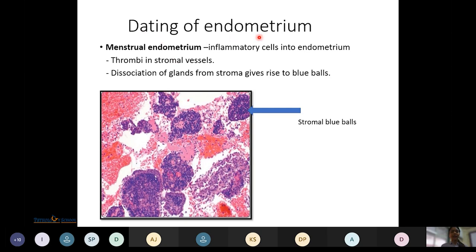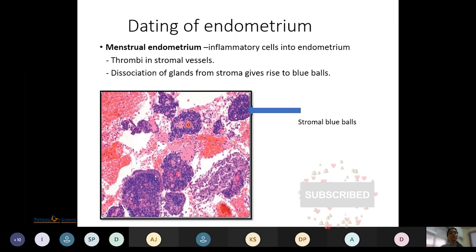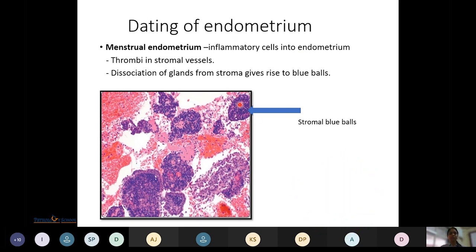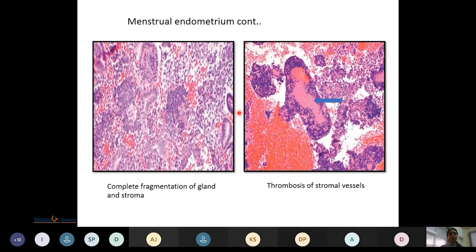For menstrual endometrium dating: inflammatory cells are seen, there are thrombi in stromal vessels, and dissociation of glands from stroma gives rise to stromal blue balls due to condensation and collapse of stroma. Microscopically, there is complete fragmentation of glands and stroma, thrombosis of stromal vessels, and pink fibrin material is visible.